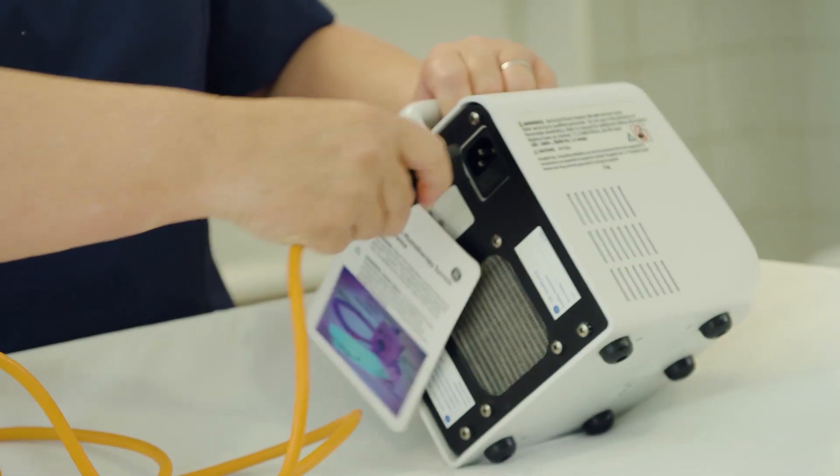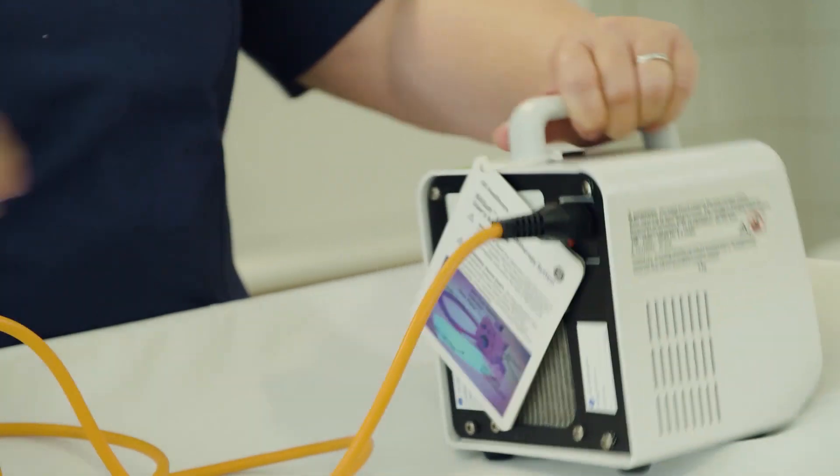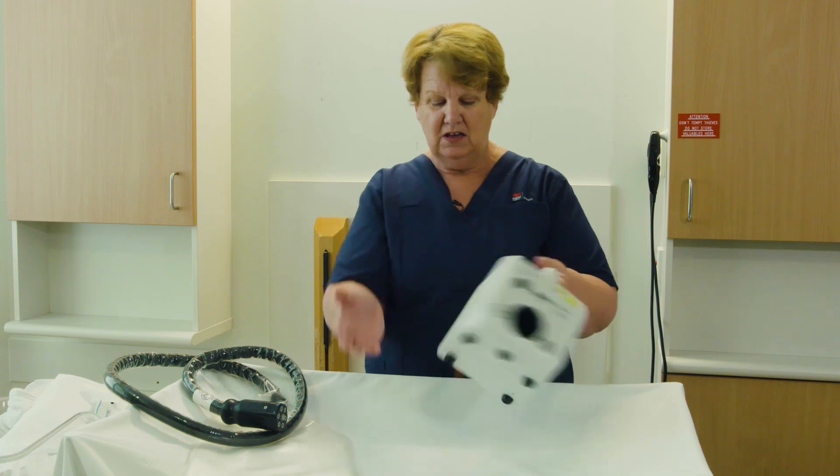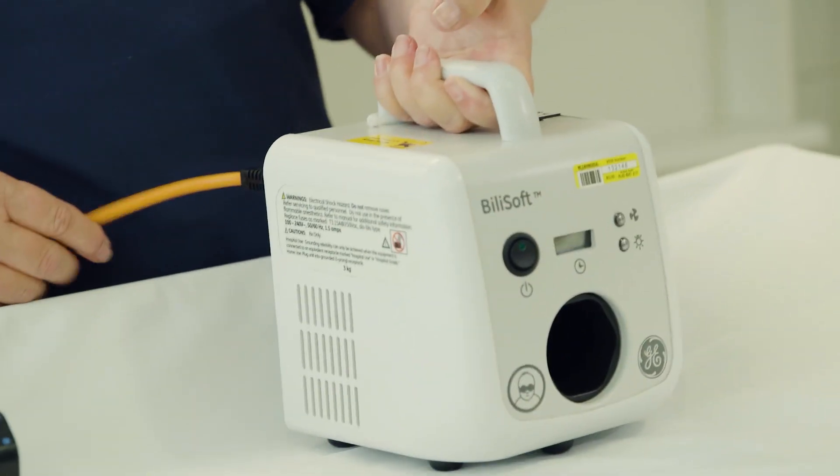The power cord connects at the back. The air vents should be kept free of all materials for free flow of air so that the machine doesn't overheat.